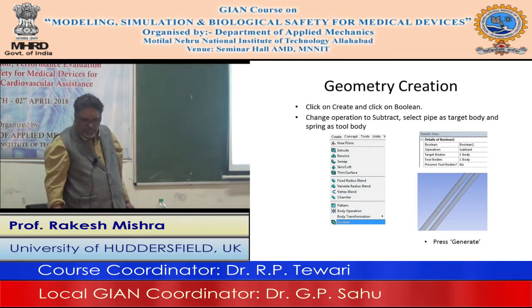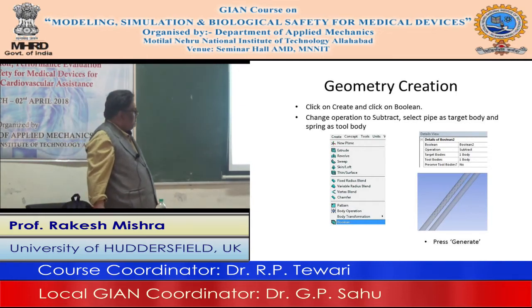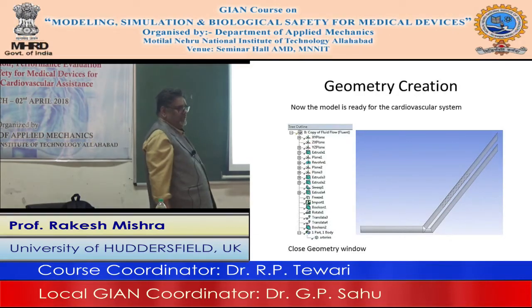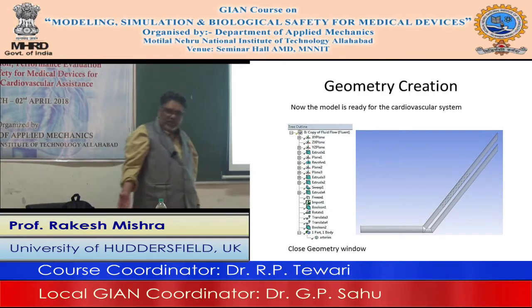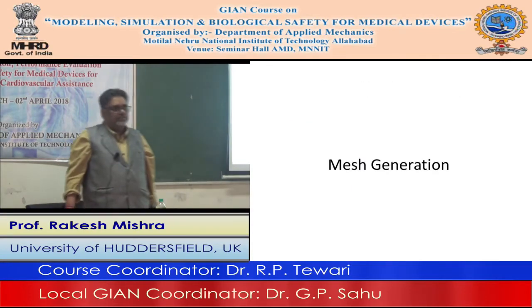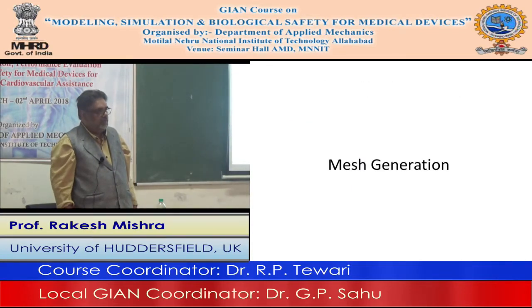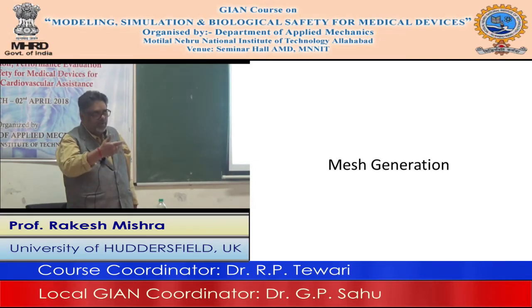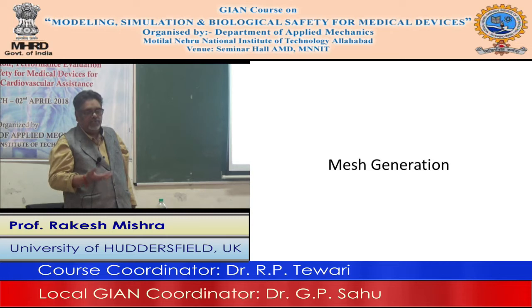So we have now an arterial system with a complex bifurcation here. So this is very simply the geometry. This is very simple geometry. We don't have much complications beyond this. This is geometry creation. Now you can make it very complicated if you want to create a stent right from the beginning. So if you want to create some more complicated stents, you can use SolidWorks or you can use any other software. For this particular case, you can use this stent that I have created. Okay.